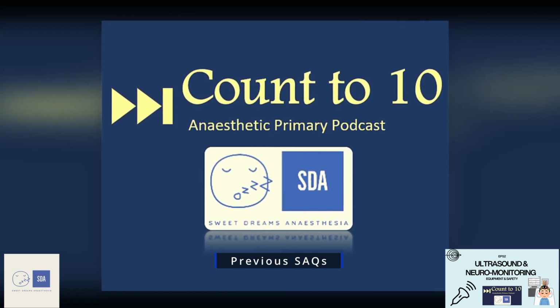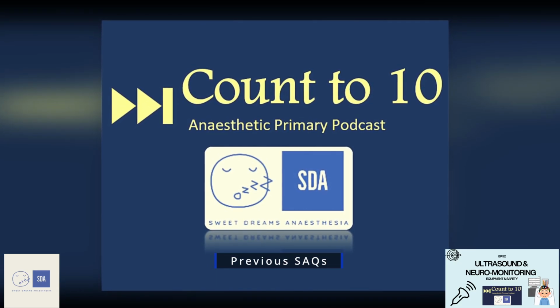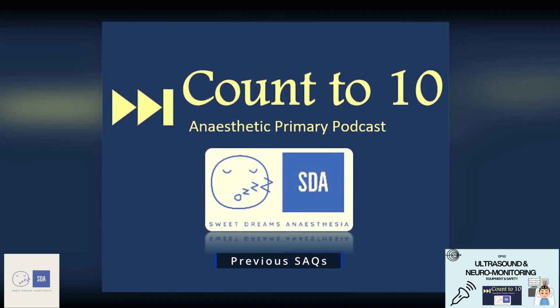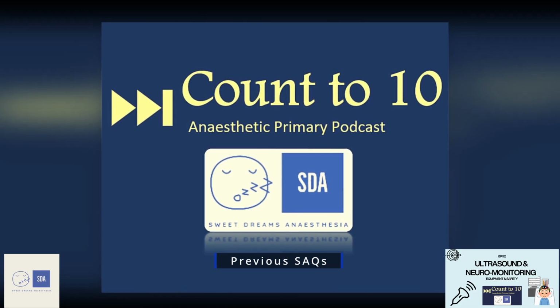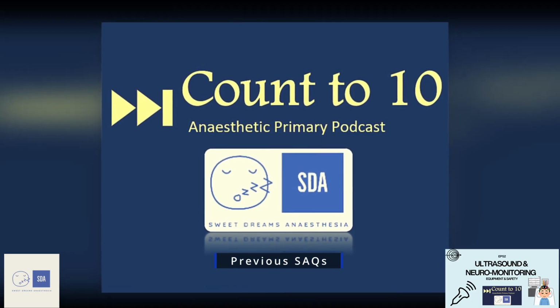With regards to Doppler ultrasound, this refers to a specific mode of ultrasound which relies on the understanding of the Doppler effect. My simple exam definition of the Doppler effect was a change in sound frequency of a moving object relative to the observer, adding in that as the sound moves towards the observer, this leads to a higher frequency pitch, and when the sound moves away from the observer, this leads to a lower frequency pitch. This is due to a change in frequency and wavelength because the velocity of sound remains a constant.